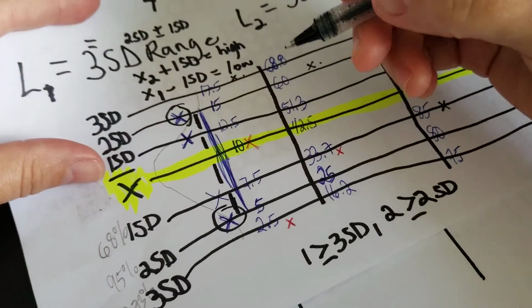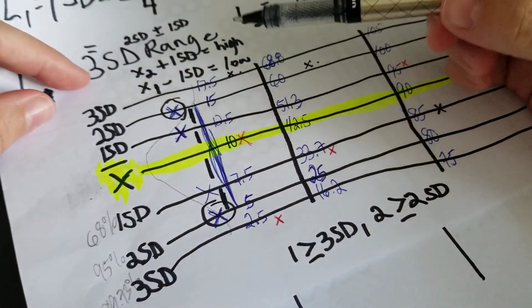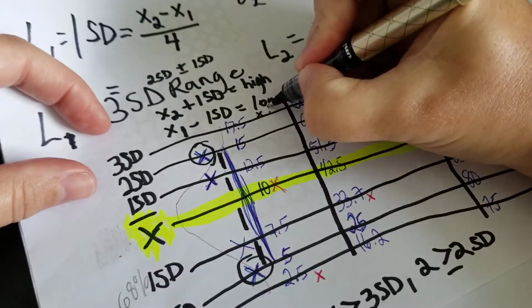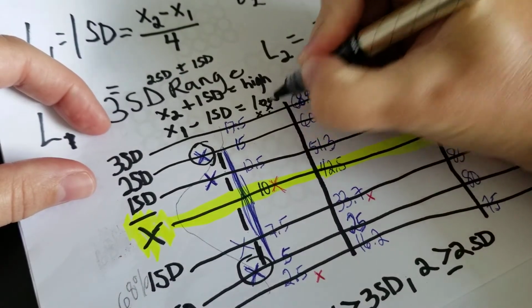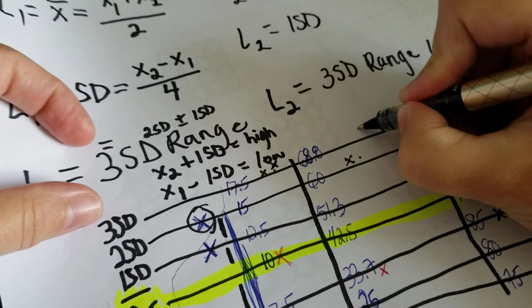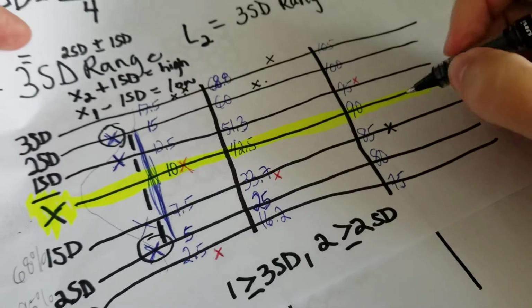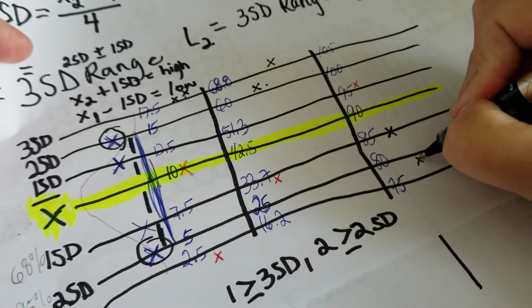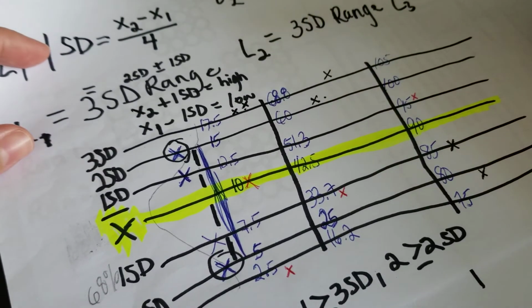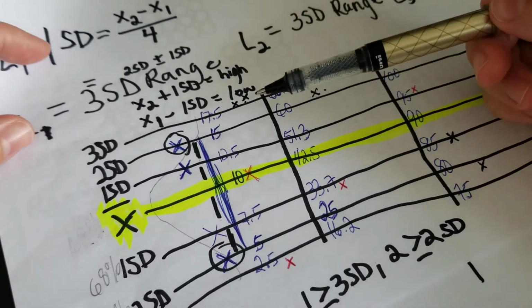So let's plot it. So level 1 is 20. Where is 20? Oh, wait. Way up here again, right? 20. The second one is 69. That's up here. And level 3 is 79. That's down here. Okay, so now, did it get any better? No. It got worse, right?